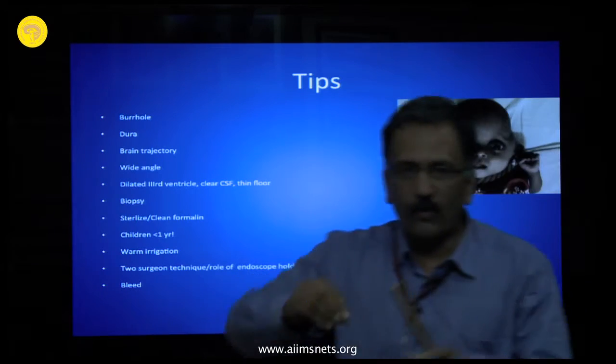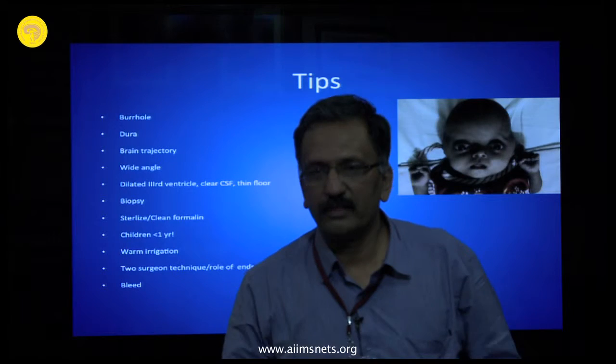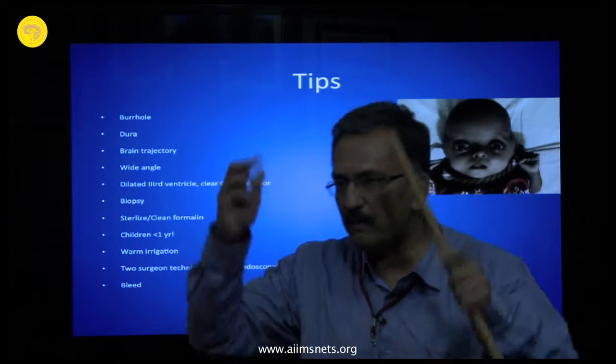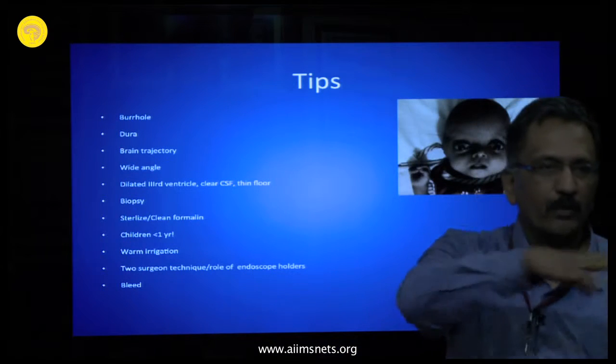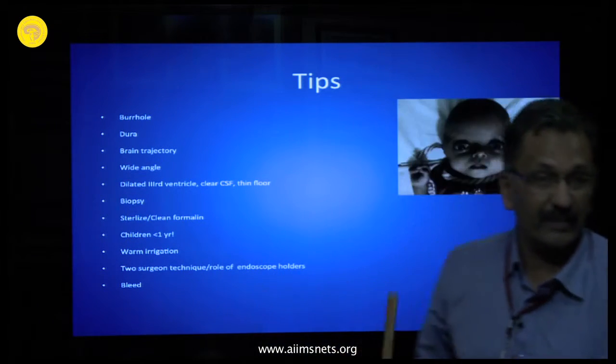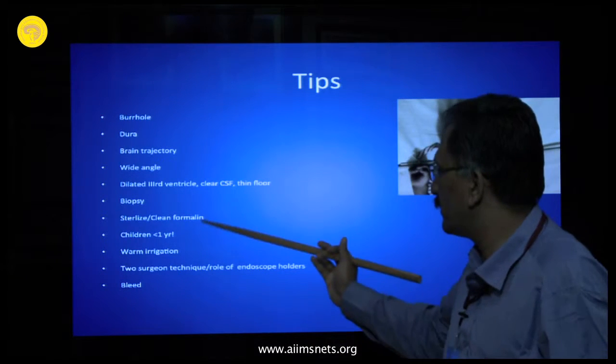This is all sterilized in formalin in most of our centers, and this may cause severe ventriculitis. So just make sure that you completely clean it, irrigate it well, irrigate your endoscopes, irrigate everything, especially the lens systems, because this will cause severe ventriculitis.